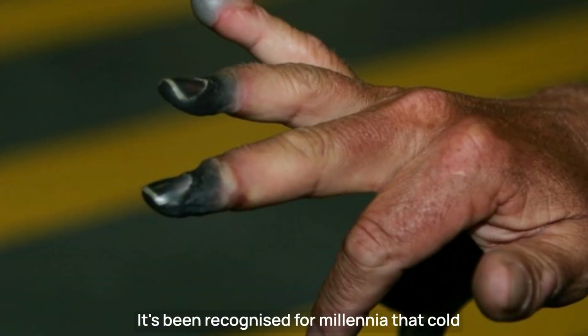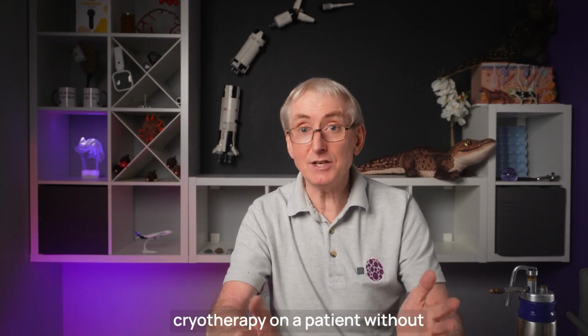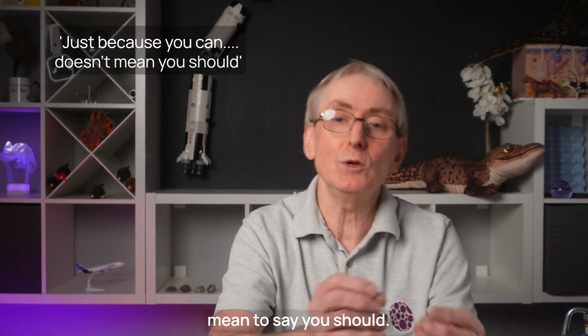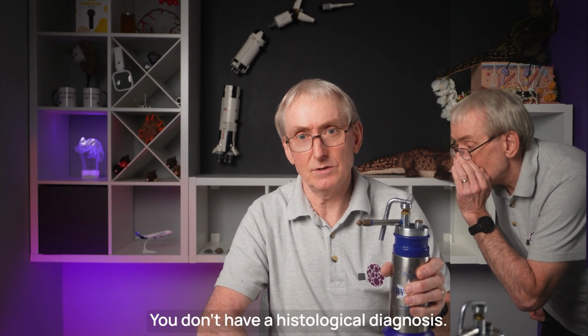It's been recognised for millennia that cold can cause you to lose limbs or even kill you. I have seen doctors use cryotherapy on a patient without knowing what that skin lesion is. Just because you can doesn't mean to say you should. As you pull out your gun, always remind yourself of this fact. You don't have a histological diagnosis.